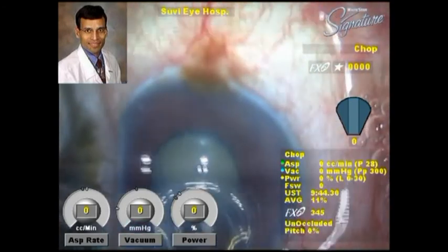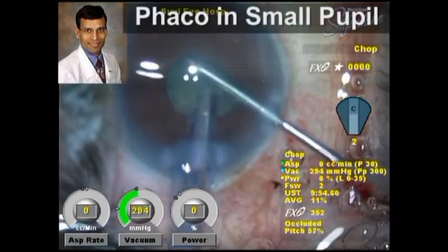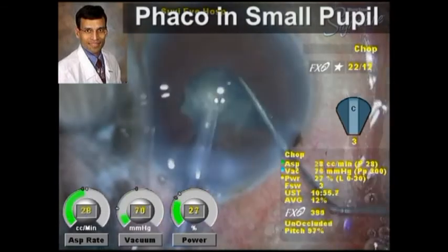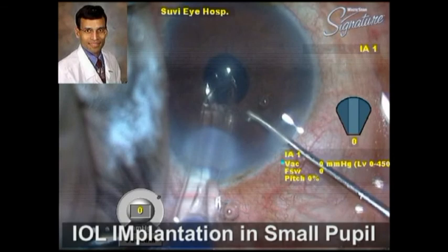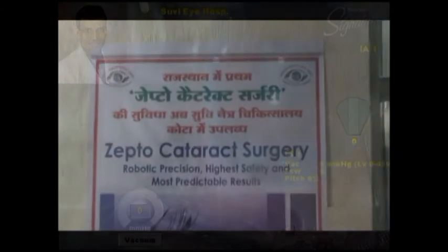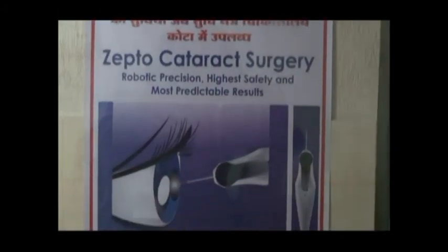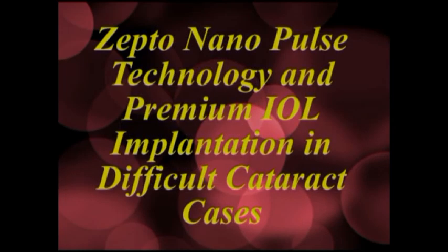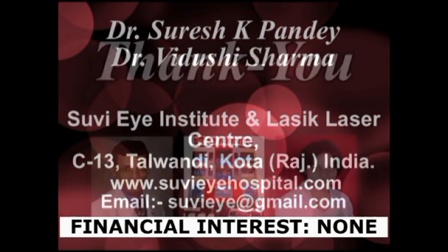It is a good idea to enlarge the pupil using pupillary expansion devices to make yourself more comfortable during surgery, using a second instrument to provide visualization in the area where you are operating. The phaco emulsification has been done and the IOL has been placed. To summarize, Zepto is a new device which is extremely affordable and gives good, well-centered, smooth capsulorrhexis, especially useful in difficult cases like white cataracts and intumescent cataracts, thereby expanding the use of premium IOLs which would otherwise be difficult in these cases.